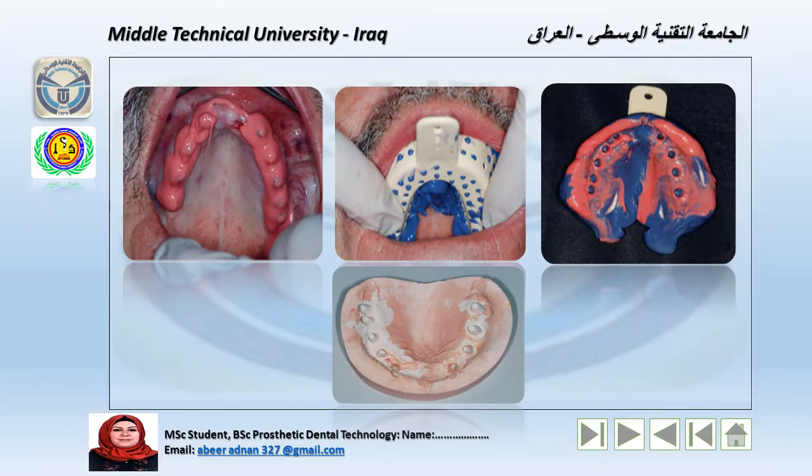The final impression is made of the abutment using light body polyether. The stock tray with regular body polyether is seated over the abutment. The final impression is evaluated. Another impression with alginate is made of the abutment and poured in quick stone to get a stone model.